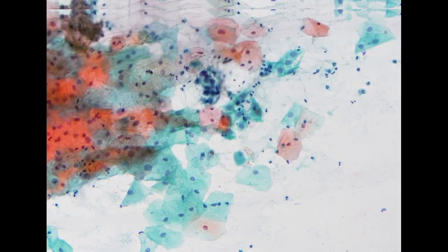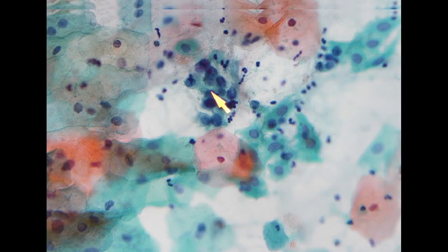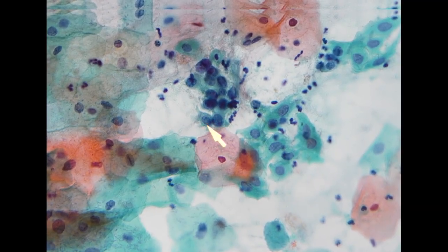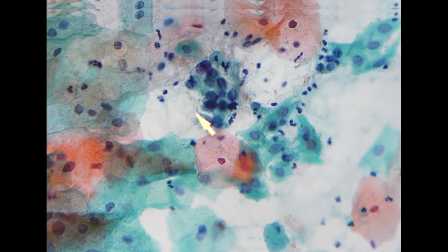So you go to high power. Again, it shows a very similar morphological pattern. You can see the striking hyperchromasia compared to the intermediate cells, and the NC ratio is high. It also shows some cyanophilic dense cytoplasm. So this, again, looks like a squamous cell. Now we think that based on the morphology, we might have a high-grade lesion, if we can find something more definite, like a cluster.